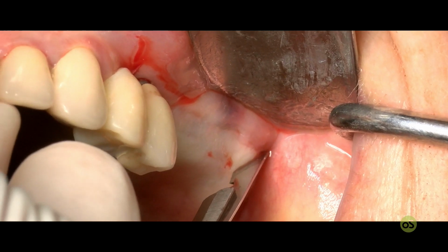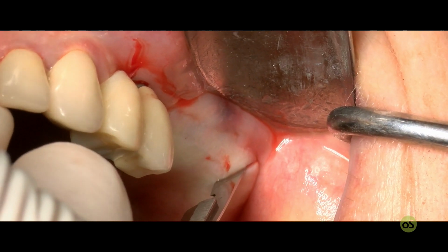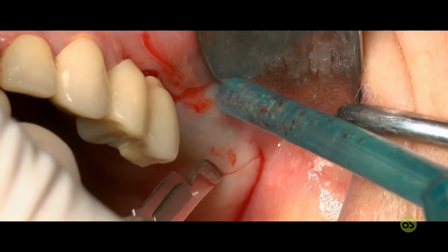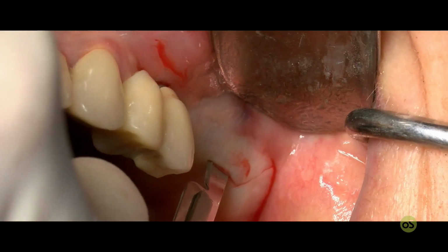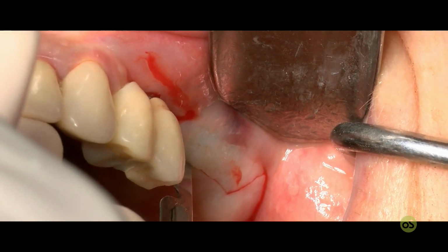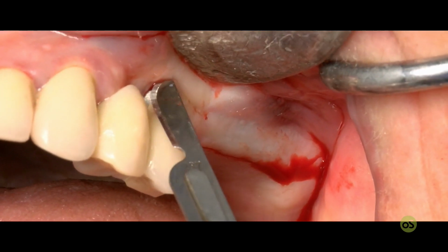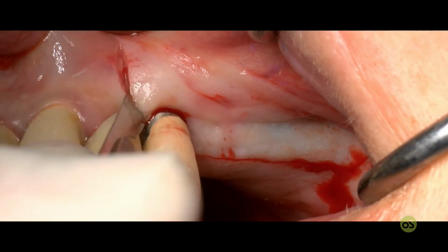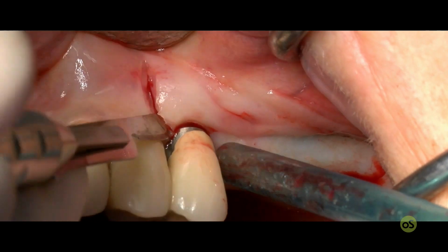We started designing the flap with the blade, the 15 blade. We start with the vertical releasing incision in the posterior area, just a little bit close to the mucogingival line. And then we perform one releasing incision even in the mesial aspect.